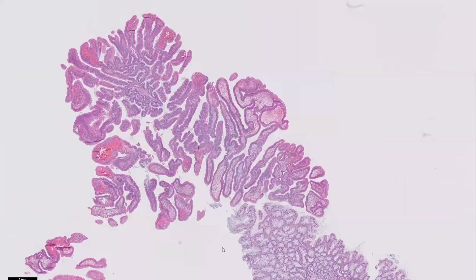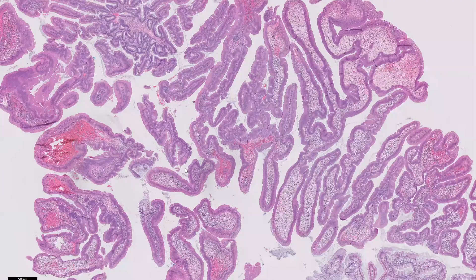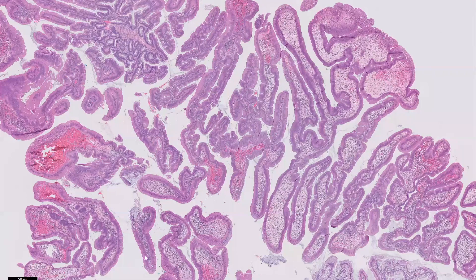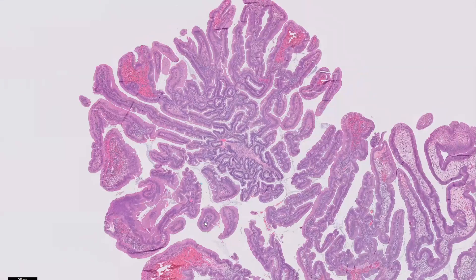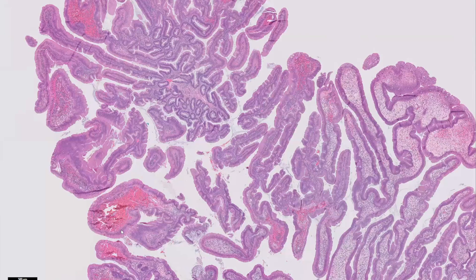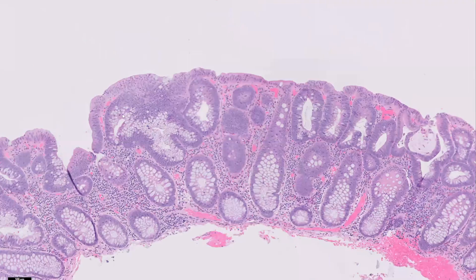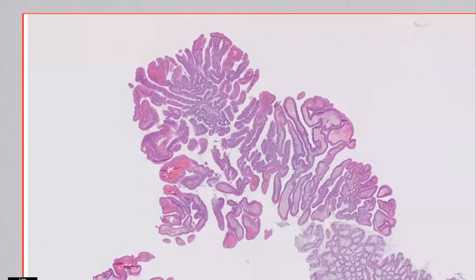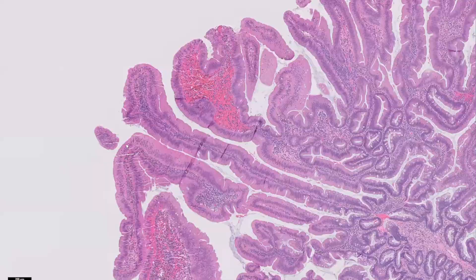Now lastly, I want to end on this polyp here — I personally find it super cute. What we see here is a traditional serrated adenoma. I'm saying serrated adenoma because this truly has low-grade dysplasia. As you can see, you have elongated, enlarged, pseudostratified nuclei, which meets criteria for low-grade dysplasia. On low power, it has a villiform look and overall looks very pink. Compared to a tubular adenoma, which is very dark compared to the background, all that pink here is the cytoplasm — there's an abundance of pink cytoplasm on higher power.